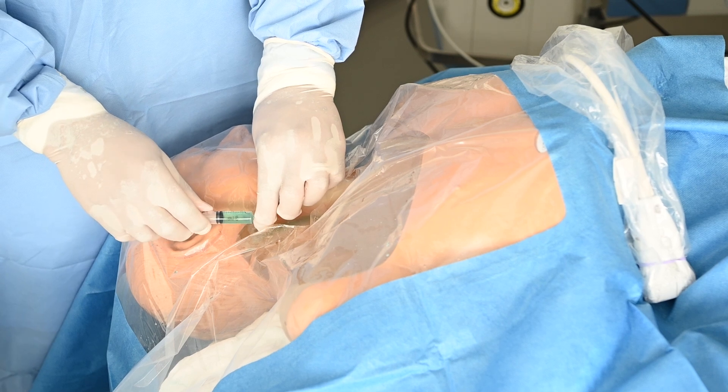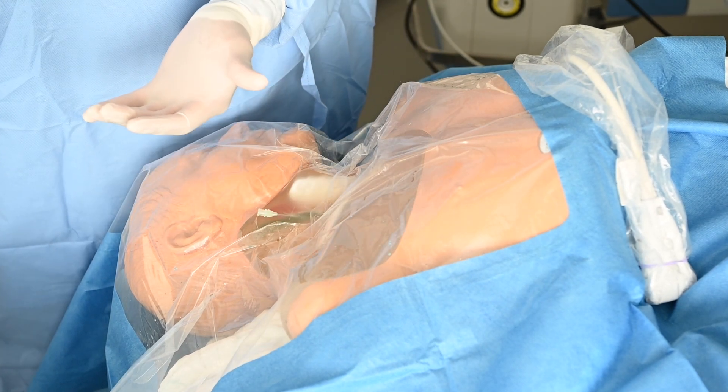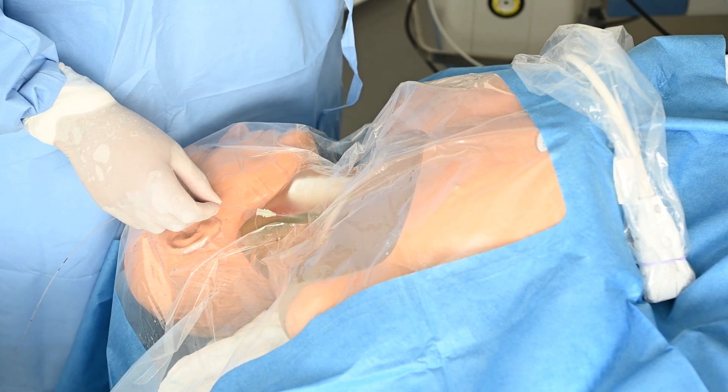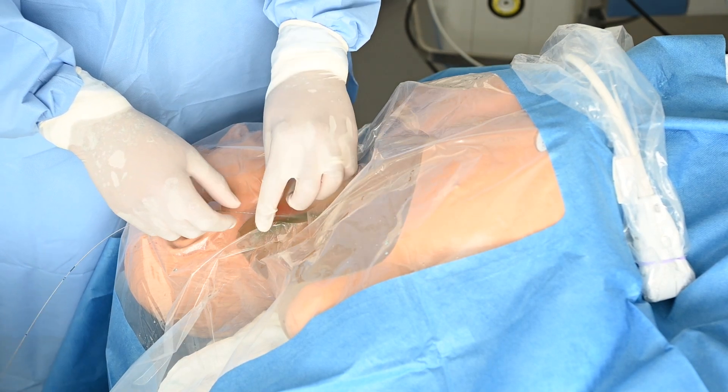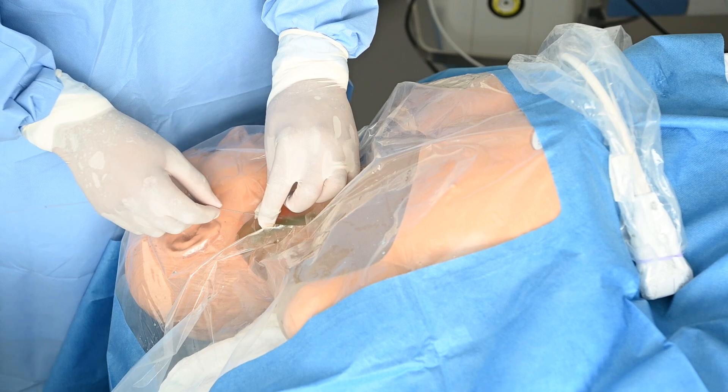So with that in mind, it's still aspirating. You can reinsert your guide wire this time, hoping it was just an angle issue or that it had been abutting the side or back of the vessel wall causing it not to advance — and not that you were in soft tissue or had punctured the wall.